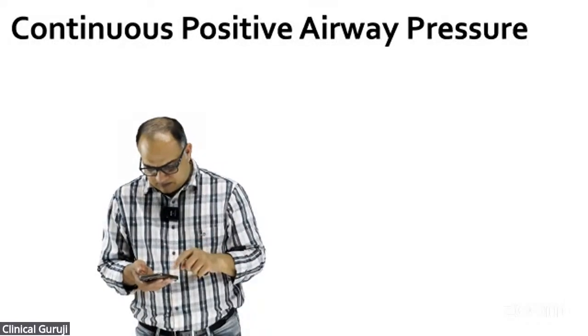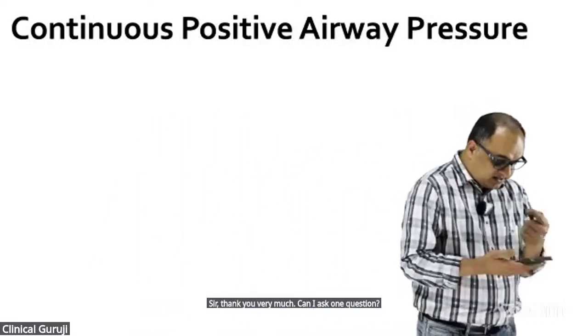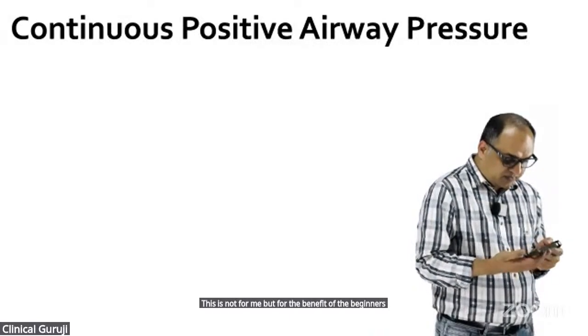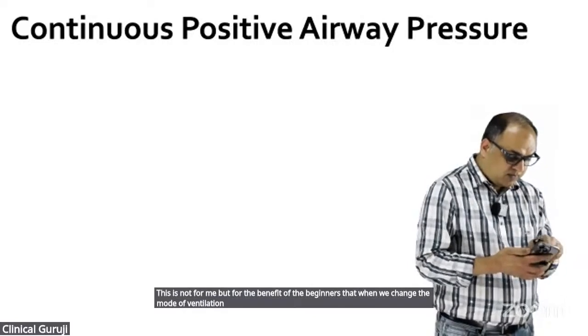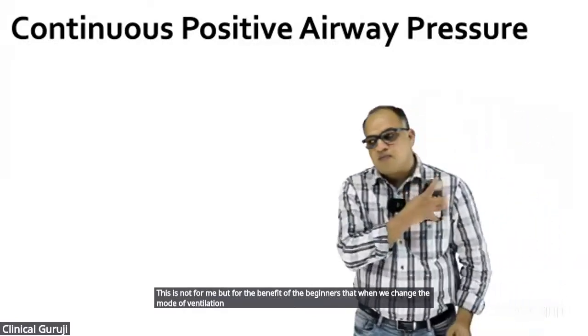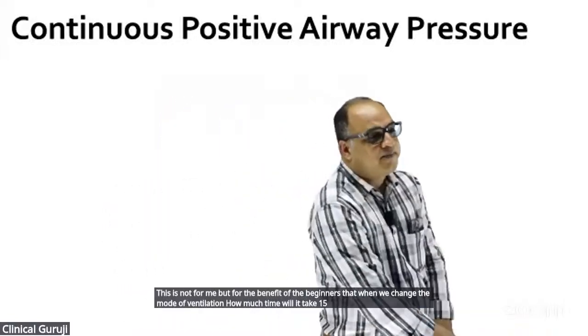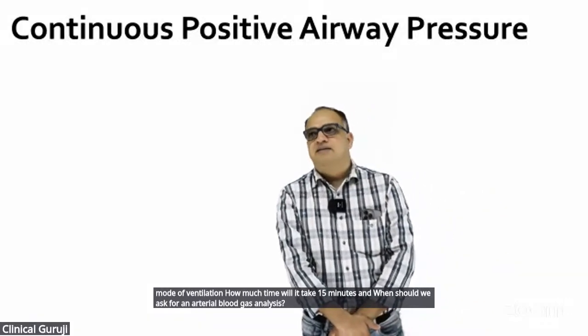Sir, thank you very much. Can I ask one question? Please, ma'am. Not for me, but for the benefit of the beginners: when we change the mode of ventilation, how much time will it take? 15 minutes. And when should we ask for an arterial blood gas analysis?